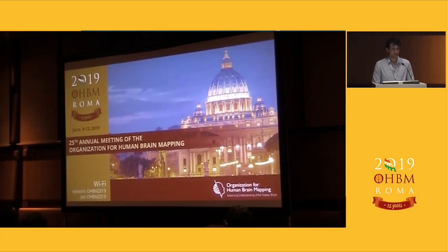And there we look at the sensory cortex, which is even worse than the visual cortex in terms of thickness. And there you expect a very similar feed-forward feedback connectivity, namely that most of the expectation of being touched is expected in the superficial layers, whereas actually being touched comes from input from thalamus, mostly in the middle layers. So in that task, we already knew to expect that, and we just tried to see if we can actually also measure it by giving participants specific sequences of being touched. So they are touched in a certain order, they learn this order, and then always need to predict which finger is going to be touched next.